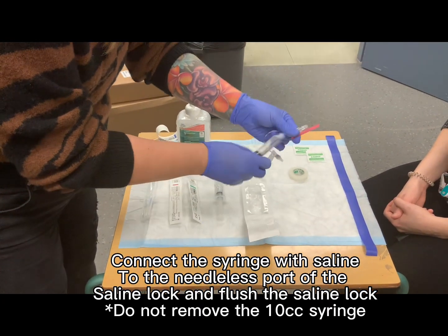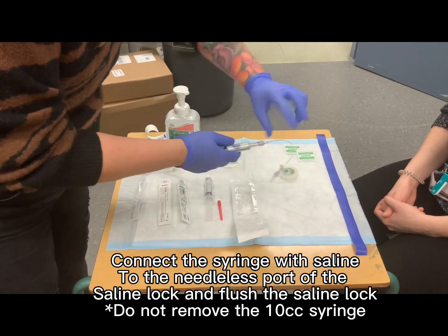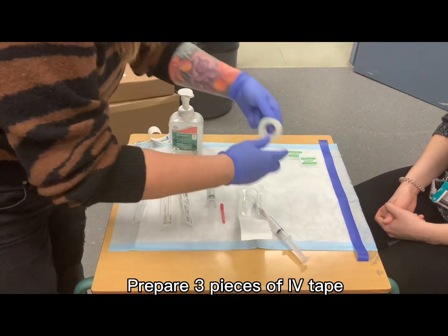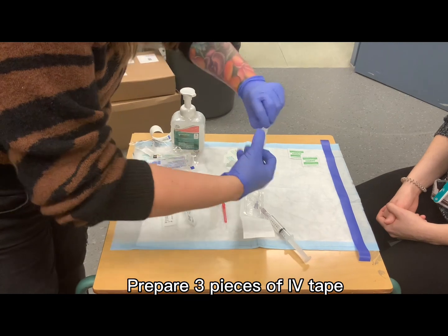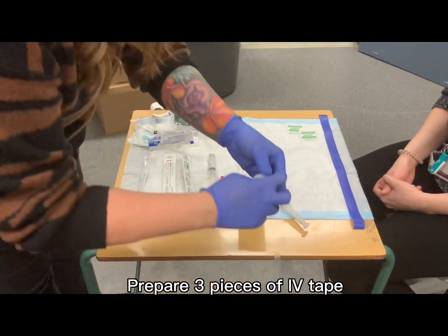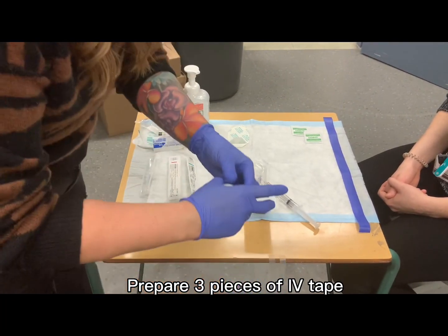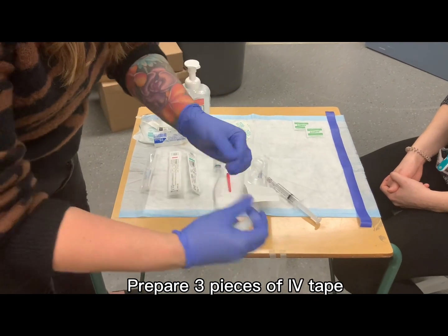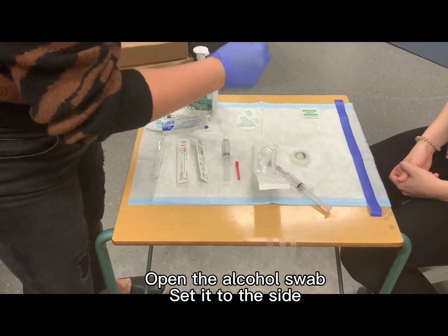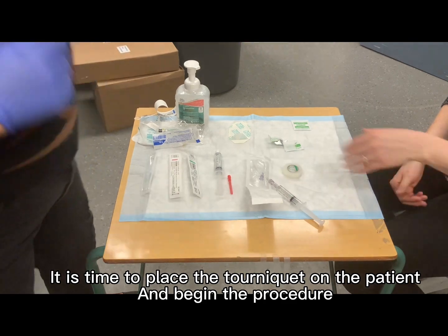Remove the filtered needle from the syringe and attach it to the needleless port of the saline lock and flush the saline lock. When finished, put it back in the plastic. Prepare 3 pieces of tape. Put this somewhere where it's clean and easily accessible when you are ready to use it. Lastly, open the alcohol swab and prepare it for use. It is now time to start the procedure.